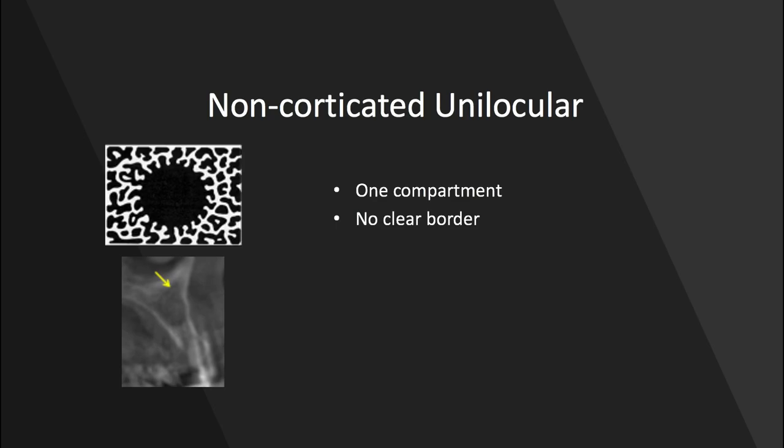We can also have the non-corticated variety. Again, we still have one compartment, but there's no clear border this time. For this radiolucency, there's no clear radiopaque border around it, and the edges are a bit more diffuse and hard to trace.